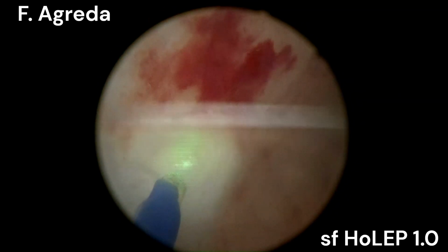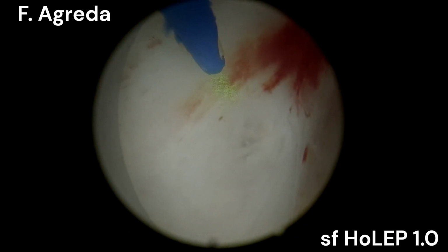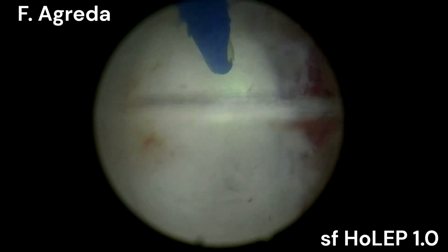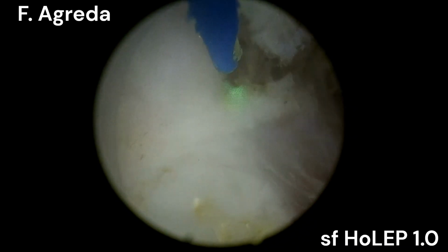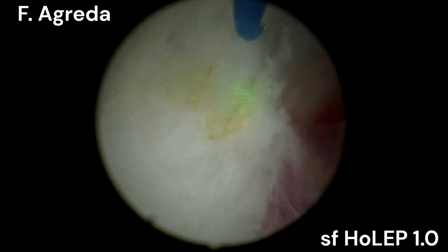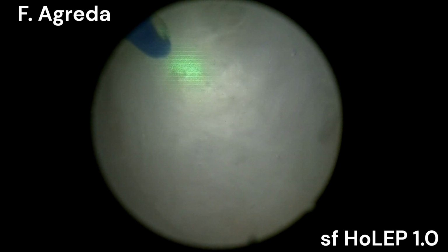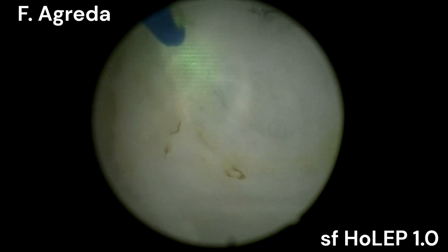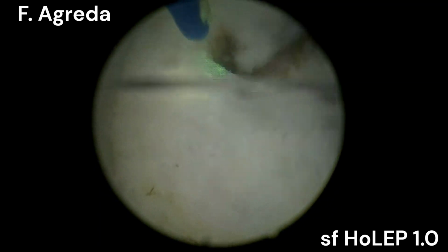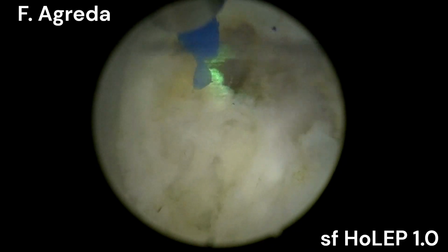Here I start with the dissection of the right lobe, same process. I mark the distal aspect of the right lobe and then I do a mucosal incision in the direction of the previously done sphincteric dissection here. Now it's all connected only in mucosa first, and then you have to deepen this dissection till you get to the capsule and the adenoma. As you can see here, it's very clear actually. It's very schematic, and you can try it in your own practice.